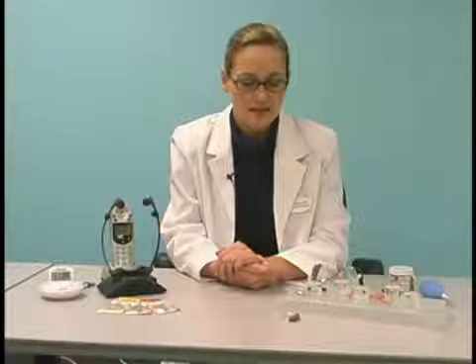One of the more common concerns that people express is that they're worried about wearing a behind-the-ear hearing aid if they have glasses, and they're concerned that the two won't fit behind the ear. And as you can see, I'm wearing a behind-the-ear hearing aid right now with glasses quite comfortably. The newer hearing aids are much thinner and very light and can be comfortably worn with most glasses.